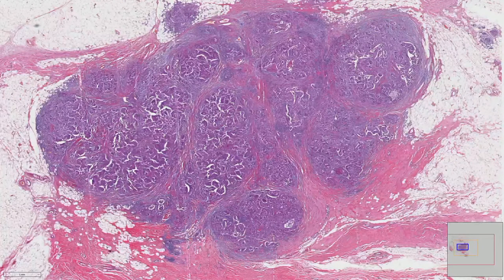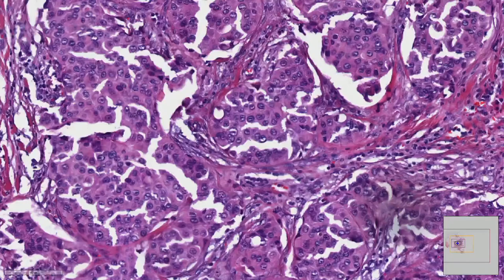The tissue is scanned digitally at high resolution, resulting in very large 80,000 by 80,000 pixel images. One can zoom in into these images to reveal different types of details of the tissue. For example, you can see individual cells or nuclei, the organization and topology of different components, and the relationship in the tissue is of great importance as pathologists use it to determine diagnosis and course of treatment.